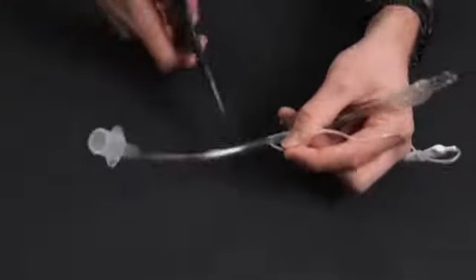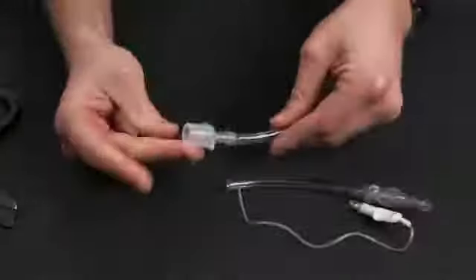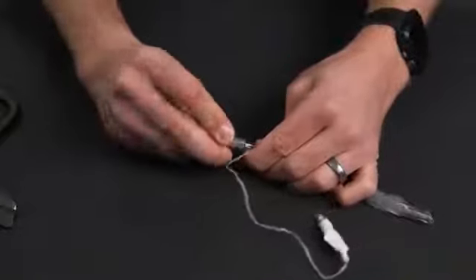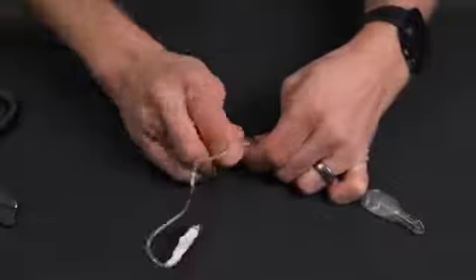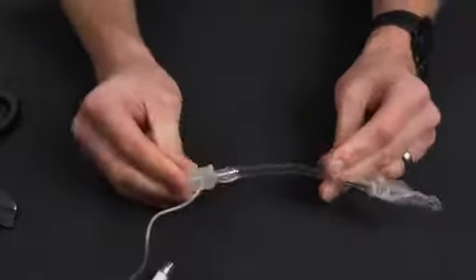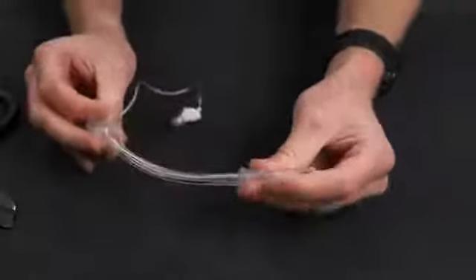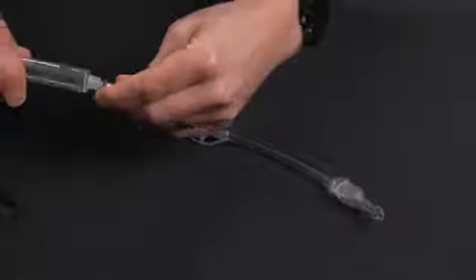So what I can do is I can take my trauma shears, I can cut right above that tube, and then I take the top of this, remove it, and we can insert it right here. Once again, this can be relatively difficult to do. So make sure you are prepped for it, and you can put that right in there, and now we have a little bit of a shorter tube, and this lumen will still work when we inflate it with our 10 cc syringe.